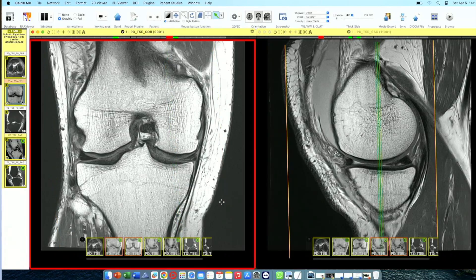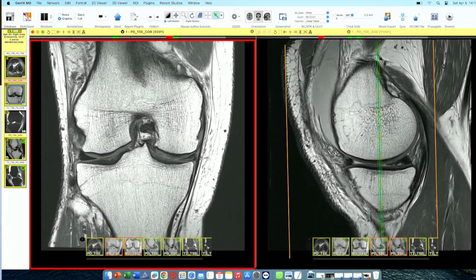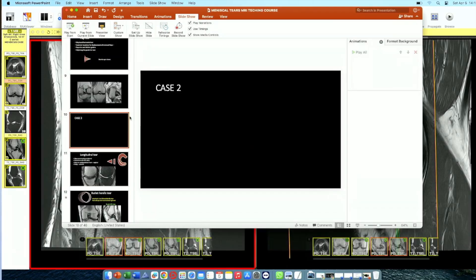Whenever there is a meniscal fragment in the notch, you need to mention whether it is degenerated or has contusion. If it's good quality, the surgeon will bring it back and repair it; if it's macerated, they may do a meniscectomy and remove the flap from the notch to relieve locking of the knee.